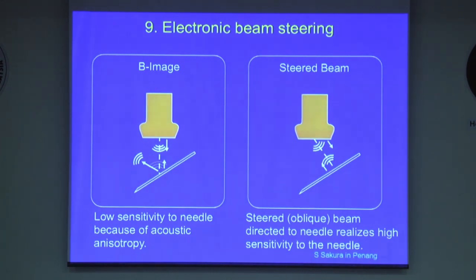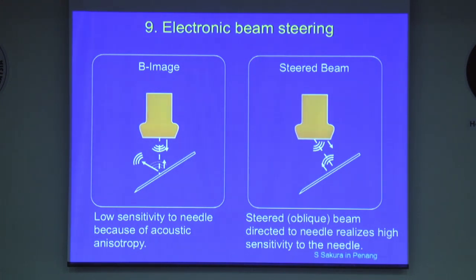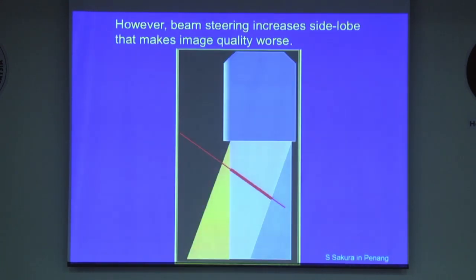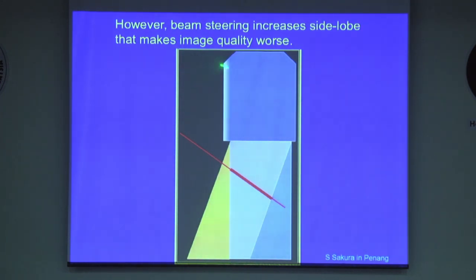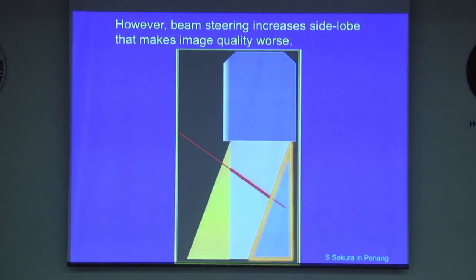You could see the angle of insertion, and this electric beam steering ensures optimal angle to reflect the ultrasound from the needle. However, beam steering increases side lobe artifacts, which makes image quality worse, especially in certain areas.